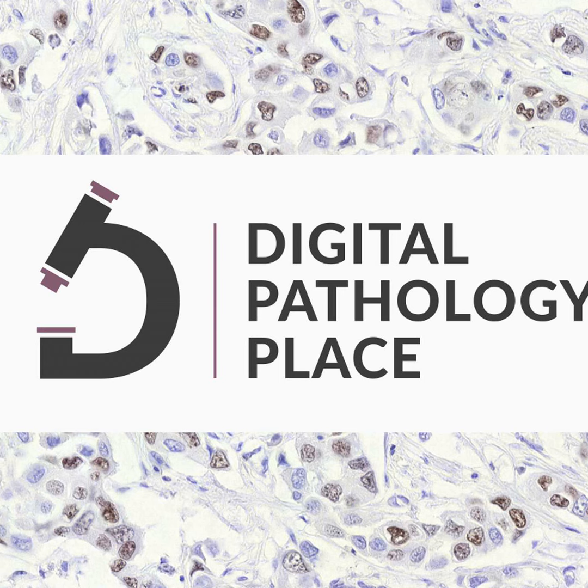So how was the initial process of matching this technology, the Aiforia technology, to the needs of pathology? And what was your experience in this, coming from a non-medical, non-pathology background? So maybe the key thing that we matched is that you need easy access for the pathologist. So no need for any software installation or going to some basement to some dedicated computer. So the web browser is basically the technology side. The user interface has always been in the website.